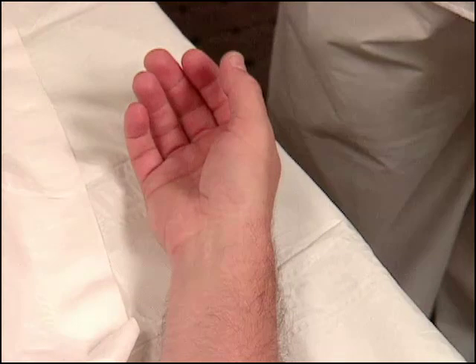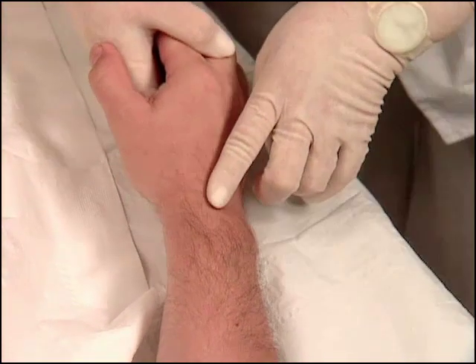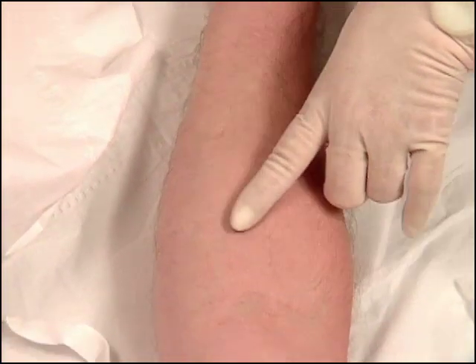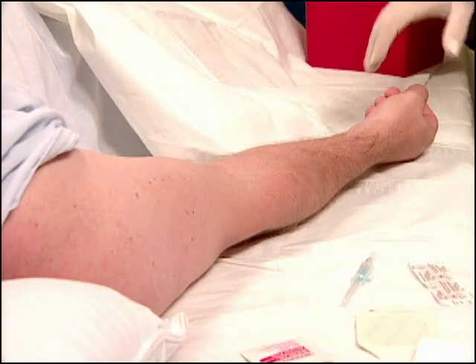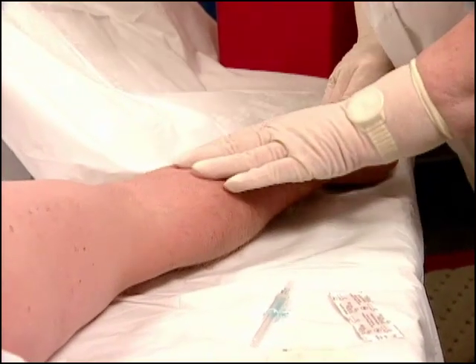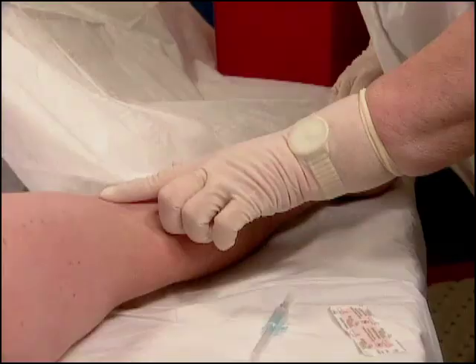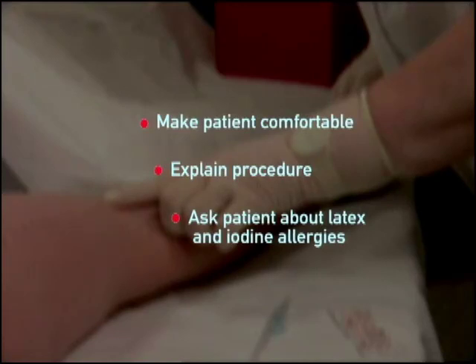Begin the procedure by asking to view the patient's arm to check for the patient ID band. Gently turn the arm, view all potential insertion sites, and select the most appropriate one based on the patient's condition and reason for insertion. Ask the patient if he or she has any known allergies. Check specifically for latex and iodine allergies. If a latex allergy is noted, use all non-latex products. If an iodine or seafood allergy is noted, cleanse only with alcohol.